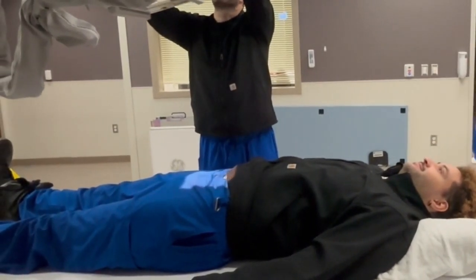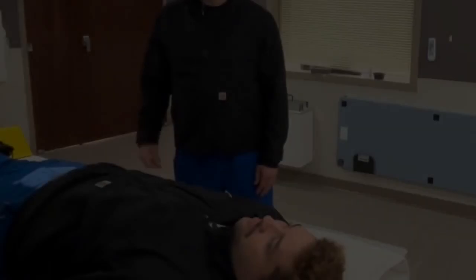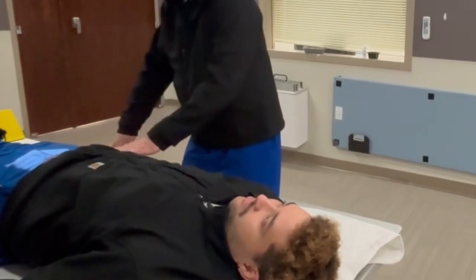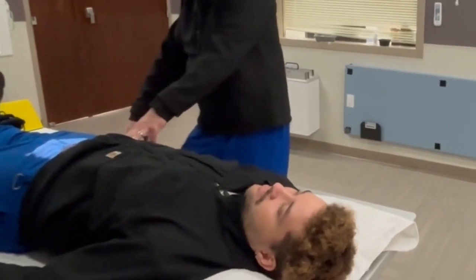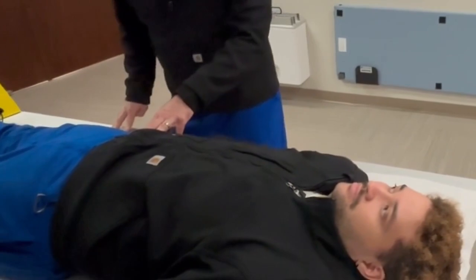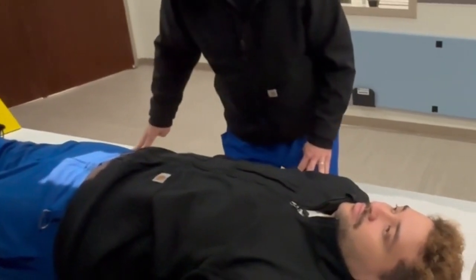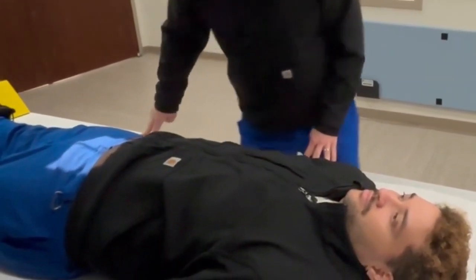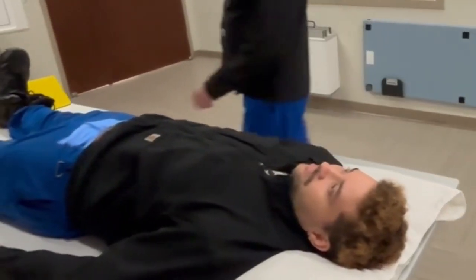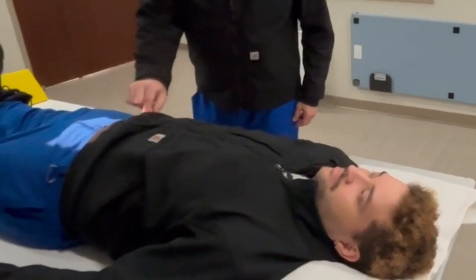We will start by getting the central ray 15 degrees cephalad. Then, feel for ASIS. Move the CR 2 inches inferior to the ASIS. Make sure that the CR is mid-sagittal on the patient. Place the right marker in the upper right corner of the light field.